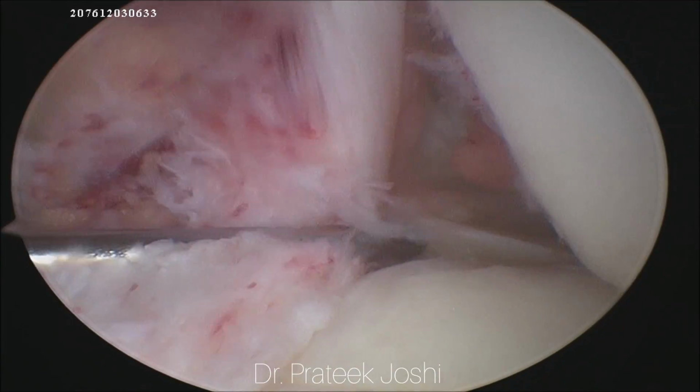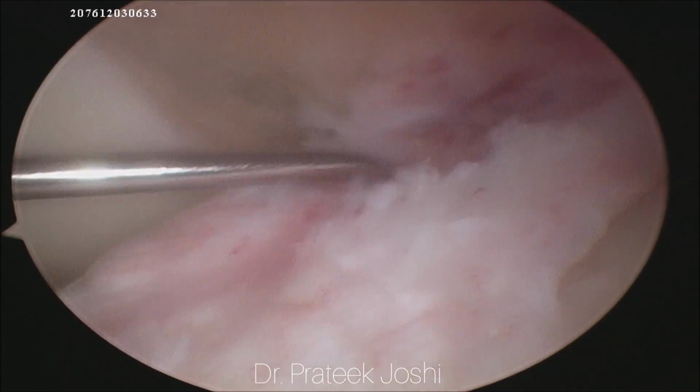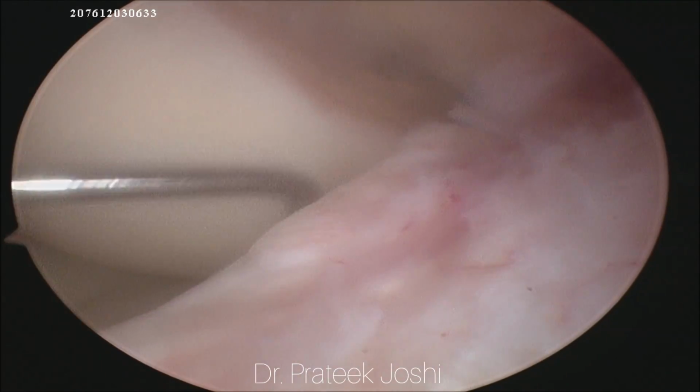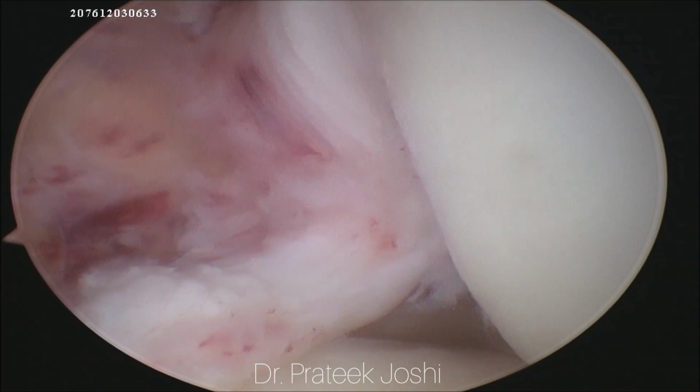Hello everyone, I am Dr. Prateek Joshi. Today we have a case of a complete ACL tear with lateral meniscus posterior horn tear in a young individual, for which we are going to do arthroscopic ACL reconstruction and lateral meniscus repair.